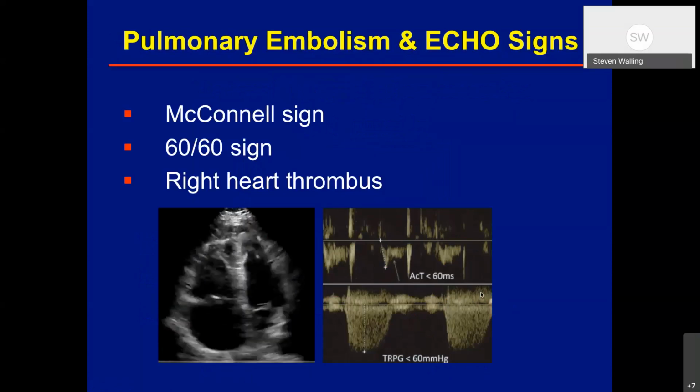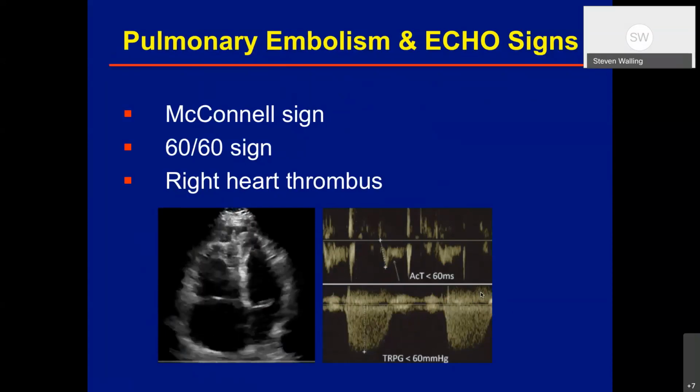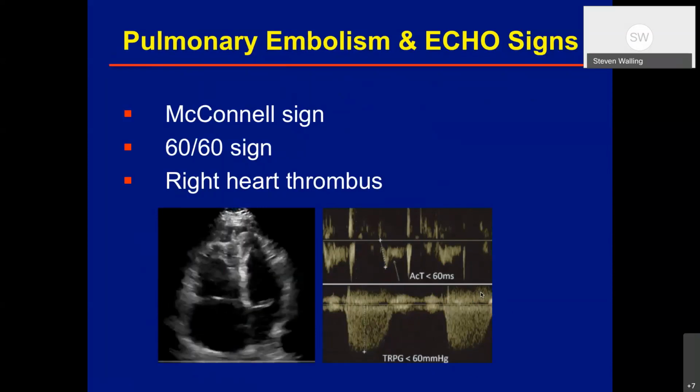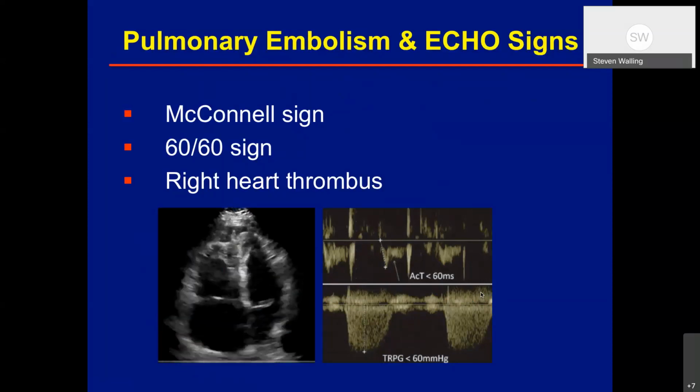Finally, I'm going to talk about pulmonary embolism. This is often the case: you guys are called, especially during emergencies, to the ED or the ICU, and they want your guidance about the diagnosis. Is this a massive PE or a submassive PE? So that they can make a clinical decision about thrombolytic or fibrinolytic therapy.